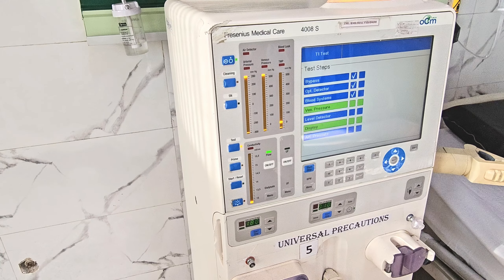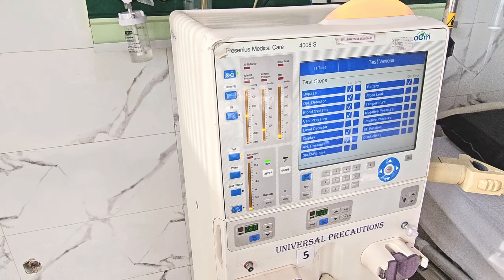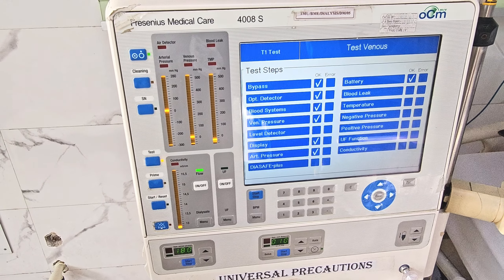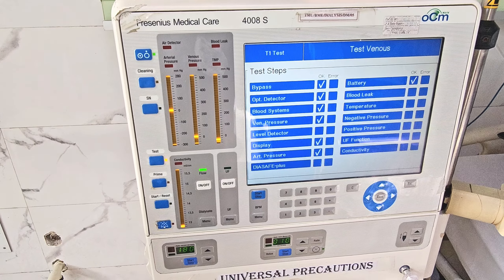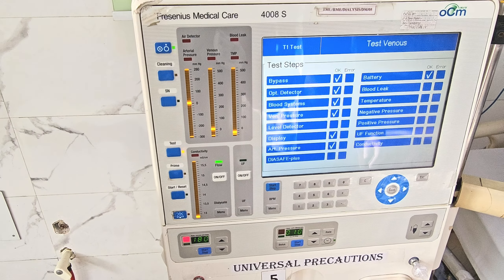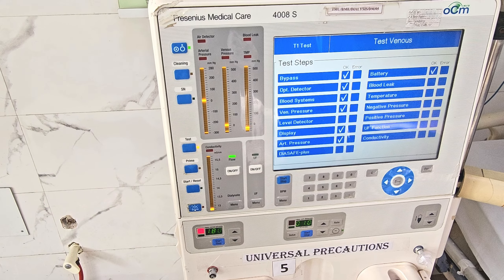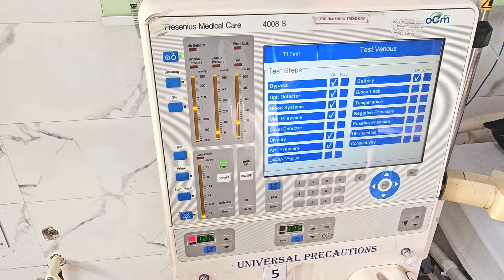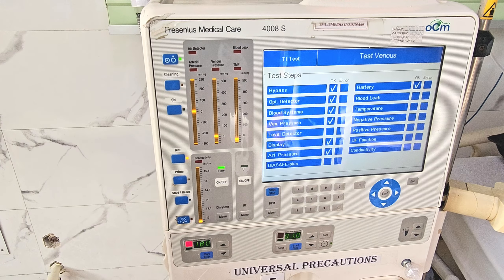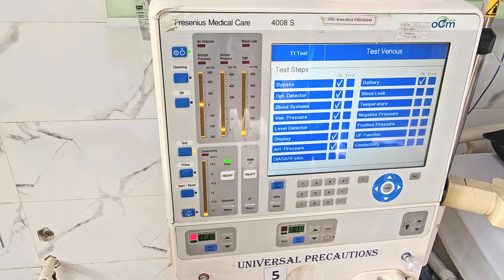It will take a few minutes. Once that auto-check is completed, the column will change to green color. On the main screen, the test is in progress — starting from battery, blood leak, and temperature — each individual parameter is being checked to make sure the machine is fully ready and there is zero chance of any error.